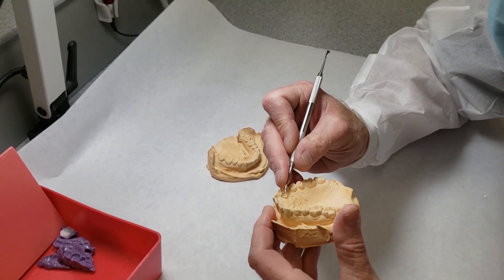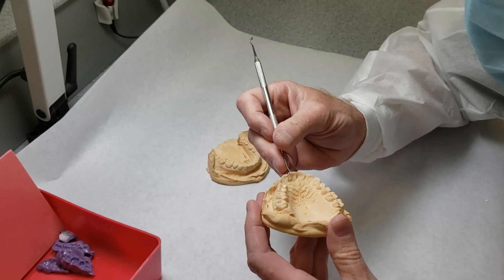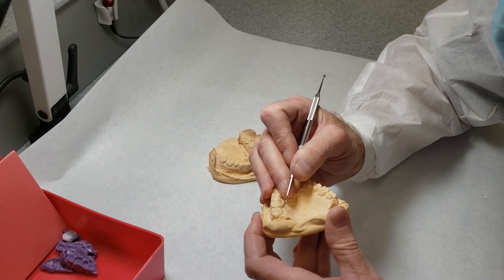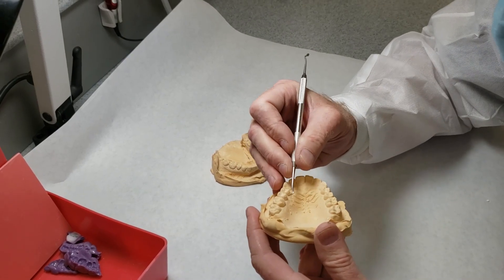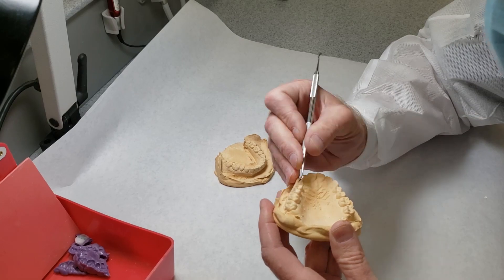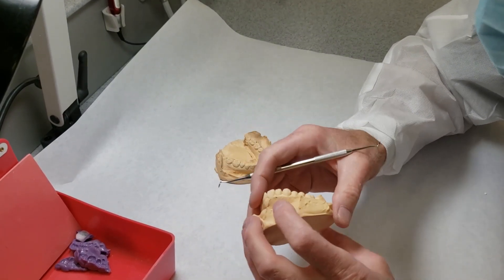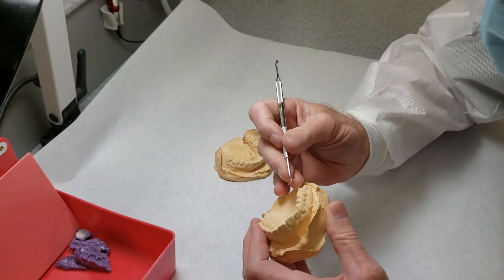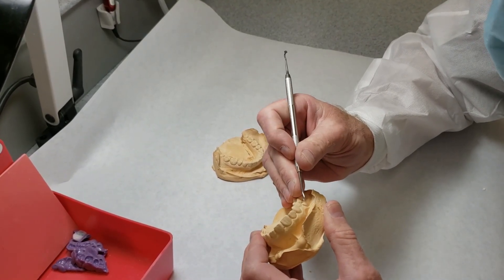The ones down on the buccal and lingual aspects are not going to be as critical when it comes to mounting accuracy, but the occlusal ones — especially if you're mounting something for crown and bridge — you're looking for something to be very, very accurate. You want to take the time to get your casts as accurate as you can.